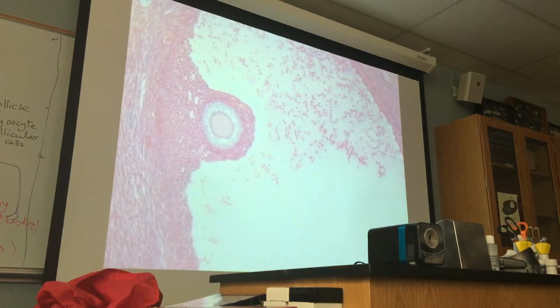Primary. No, I told you it looks like a crown. Oh, corona radiata. So it's not a corona. Follicle? No, this whole structure is a follicle. Oh, secondary follicle. And a secondary follicle has this huge space. Can you see that space? This is called the antrum. But these cells are granulosa cells. Now let me go to the lowest magnification and explain something.